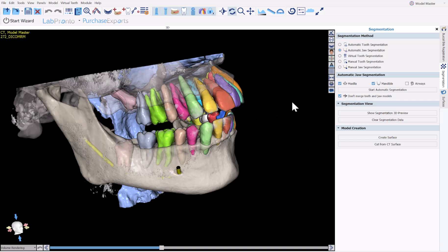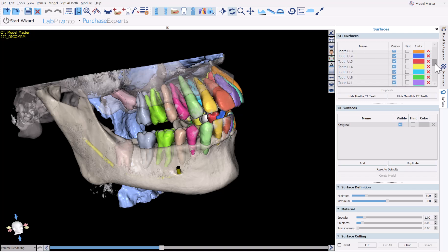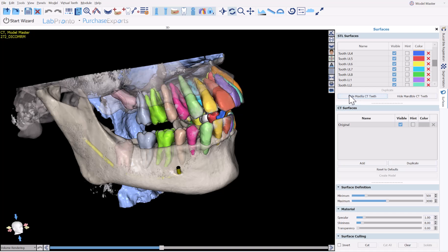If you would like the jaw to be merged with the relevant teeth, then uncheck the 'Don't merge teeth and jaw models' checkbox. Once the segmentation is completed, in your surfaces panel you will see each tooth and each jaw existing as its own surface. You can hide or show the relevant teeth for a particular jaw by clicking hide/show CT teeth for that jaw.